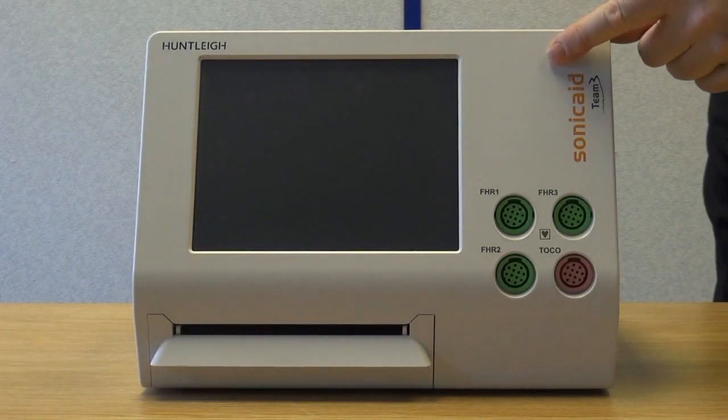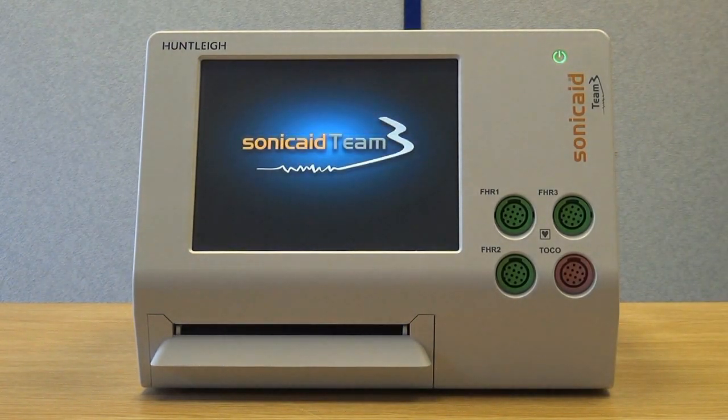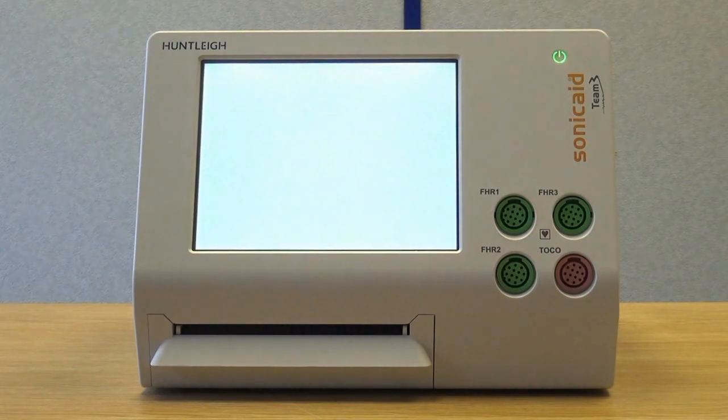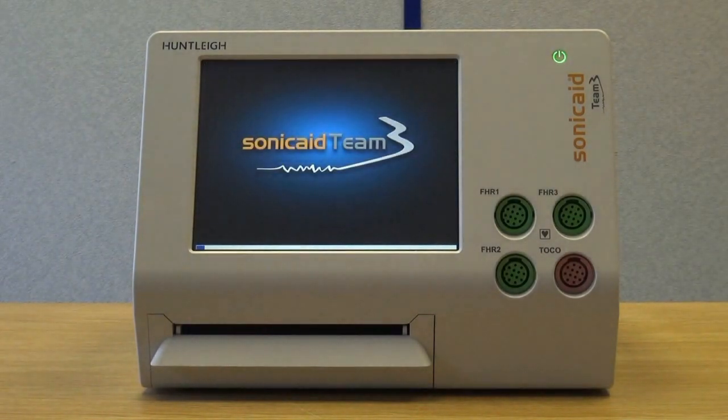Touch the power button on the right-hand side of the unit as shown. This is touch sensitive so only a light touch is required. After a short delay, the power button lights up green and a loading screen shows on the unit. You may also hear a bleep. After a short start-up period, the unit is ready for use.